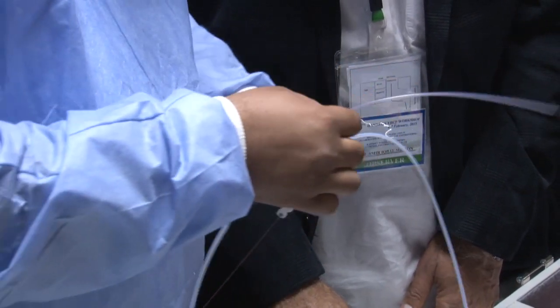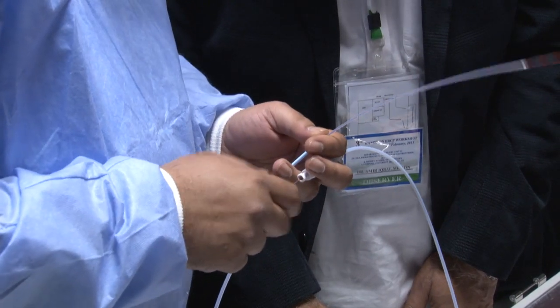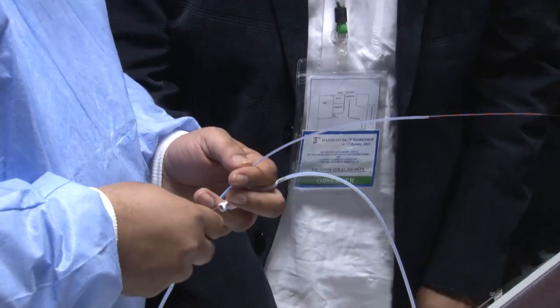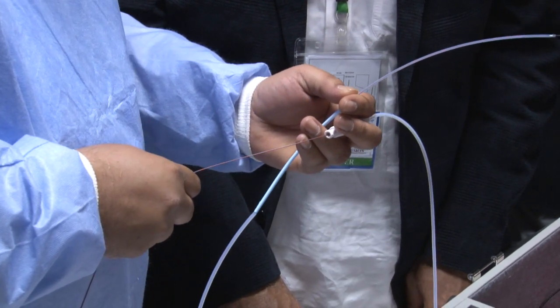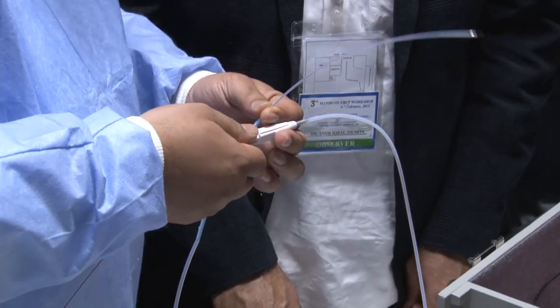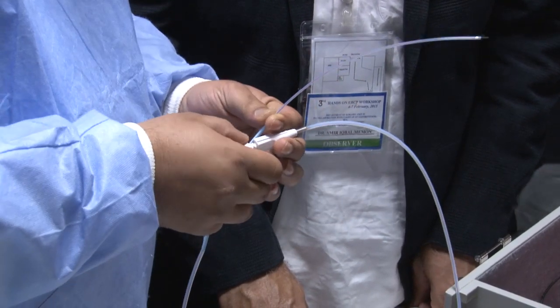There is this fear that sphincterotomy would increase the risk of perforation. We have now done over 800 sphincteroplasties, and our experience is very clear. We have not encountered a single perforation in any of our patients, and I don't understand why. I only use balloon sphincteroplasty after I know that I have not been able to remove the stone.